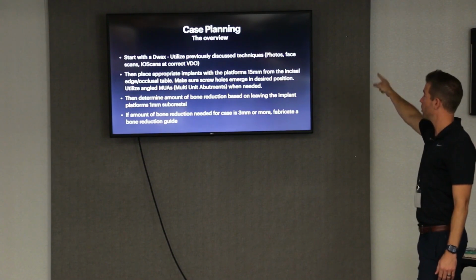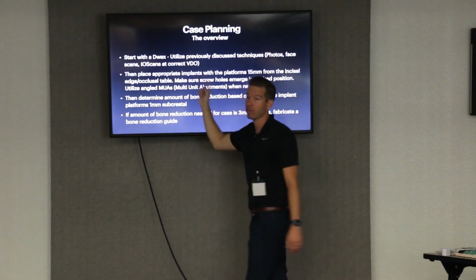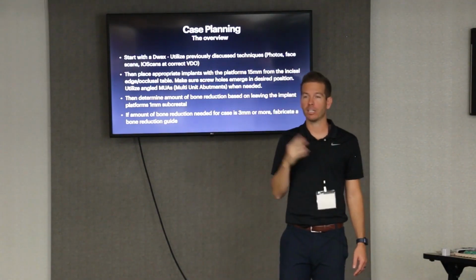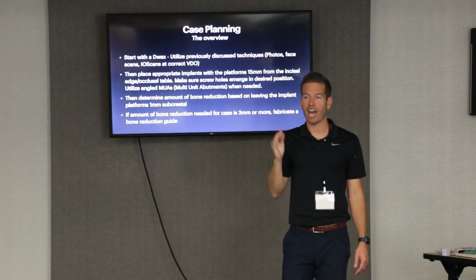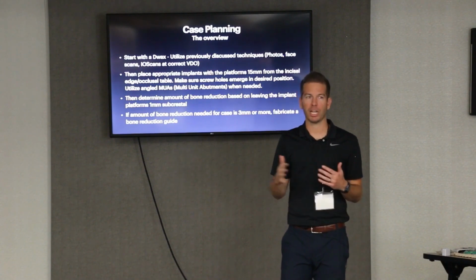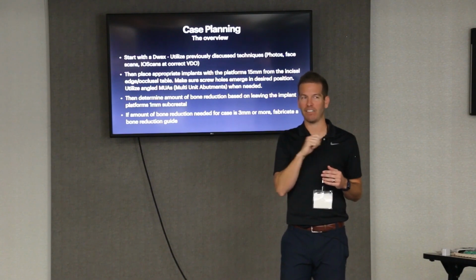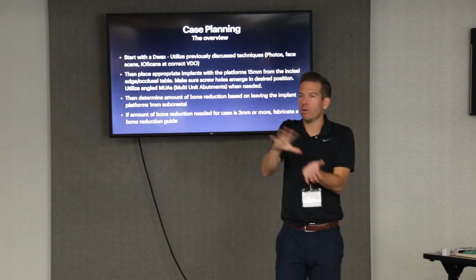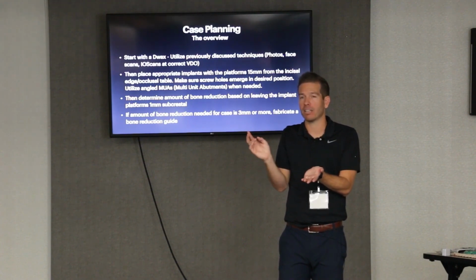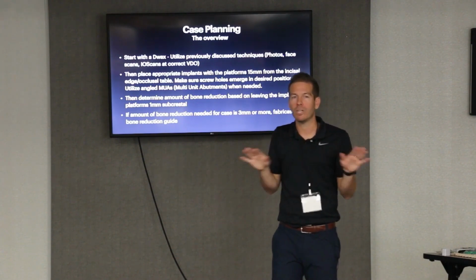So the photos, the face scan, and then just what he's talking about, your intraoral scans at the correct VDO. On that records day, when you're taking your records, you've got to start thinking VDO. I mean, the patient's going to go through a temporary, so you can change that. But if you don't lock in that VDO at the scan of the patient, what you load into the case isn't even the right VDO. So now you'd have to do a wax up based on a guessed VDO, and you might have to digitally open them up, which we don't like to do.